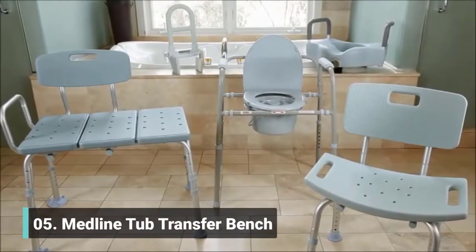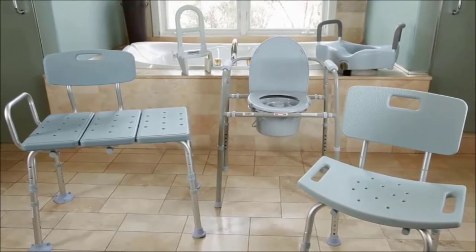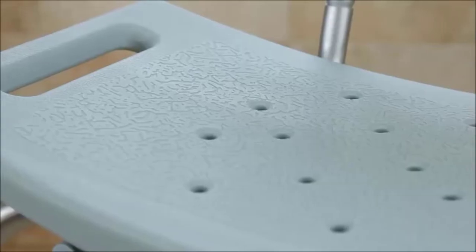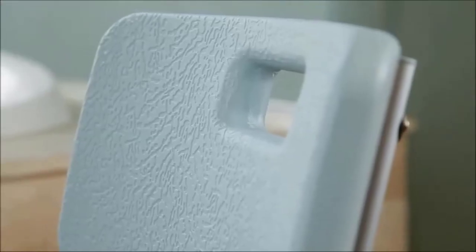Medline's Bath Safety Products with Microban include a commode, a transfer bench, a bath bench with or without a back, a tub grab bar, and a raised locking toilet seat with or without arms. The products are all infused with Microban antimicrobial product protection.